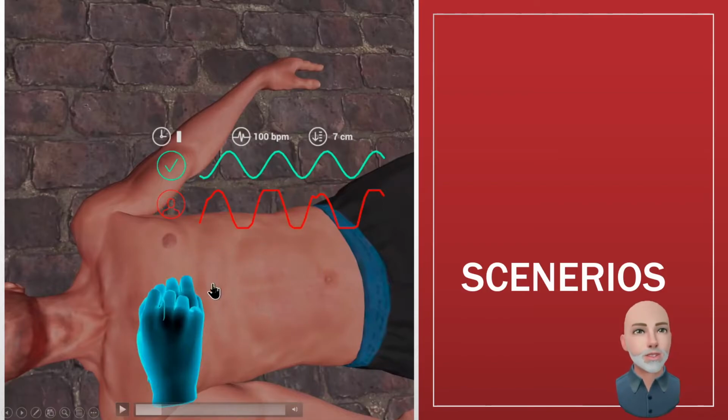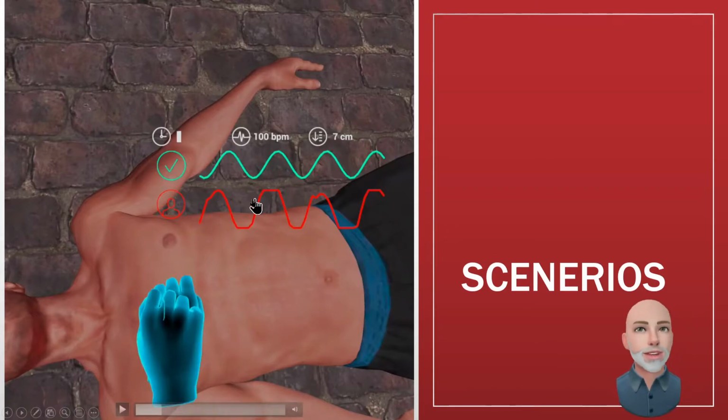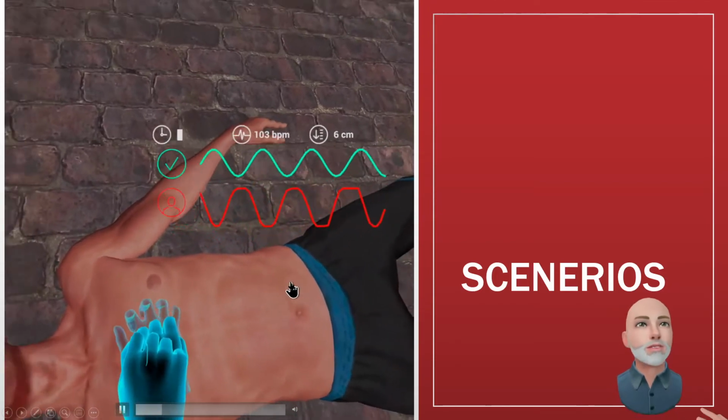So it's actually measuring depth and pace. Initially I had some trouble getting the right depth, and I had to stop and reset my boundaries and make sure my floor was set accurately, because it is absolutely measuring how far you're pressing down. If you don't have that floor depth set quite right, you'll run into some trouble. But once I found the right setting, the pillow worked fine and it measured the depth. And then again, you're going to do this.